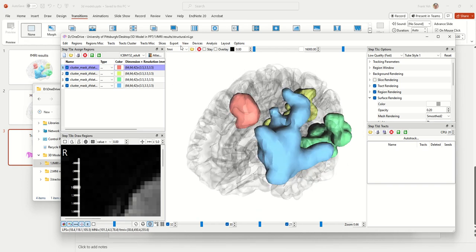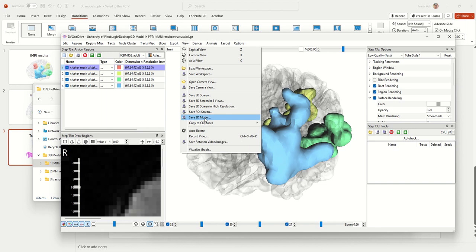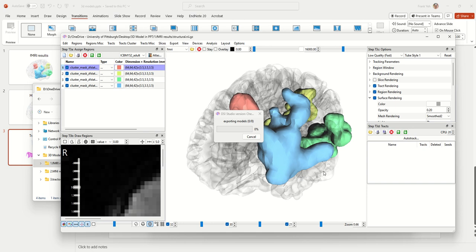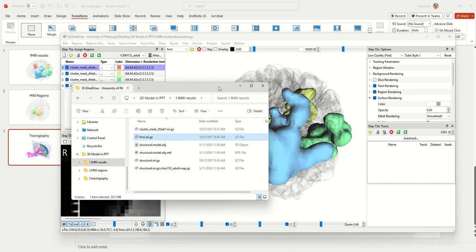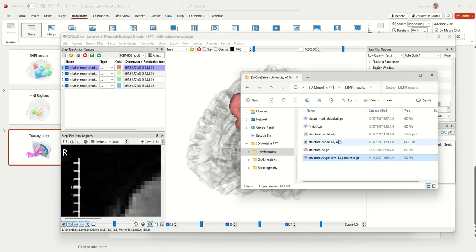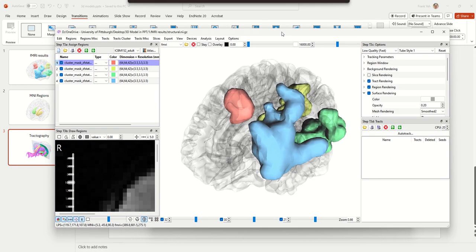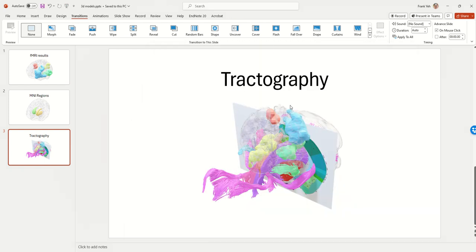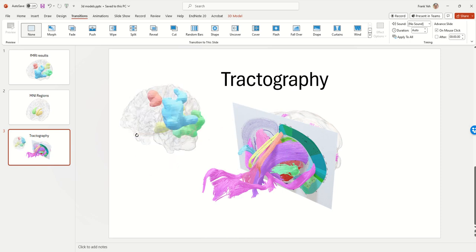Once you have the perfect view and everything ready, go to the View menu and click Save 3D Model. It will save the OBJ file with the 3D settings — just click Save once you determine the file name. It will save the 3D model; in the same folder you'll see several new files, including a .map.gz registration file for the T1, the OBJ file, and the material file. To load it in PowerPoint, simply drag the OBJ file in. You can see it's inserted as a new object and you can rotate and inspect it.